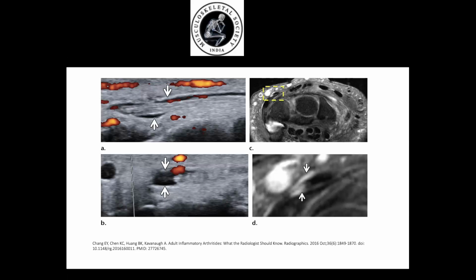Again, the role of ultrasound helps to characterize small volume effusions and tenosynovitis quite easily. Ultrasound is readily available.